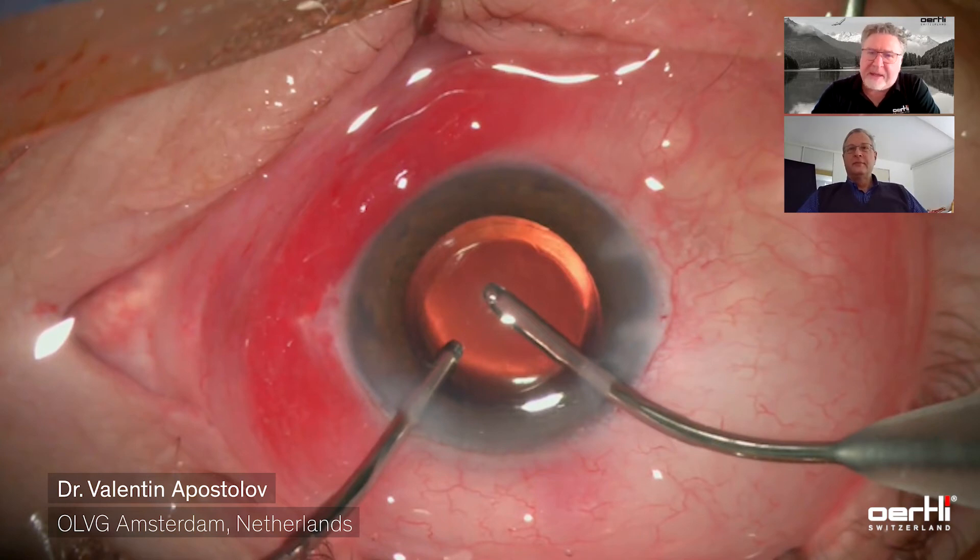I'm quite interested, and maybe our partners are too — are you working with various IOL manufacturers or focusing on one manufacturer? The vast majority of the lenses are from the same manufacturer. We like that because we have the same platform — we don't need to change the calculations if a toric lens or a multifocal has to be implanted. Most lenses are from the same manufacturer, though incidentally we use different IOLs in eyes that are far from standard.